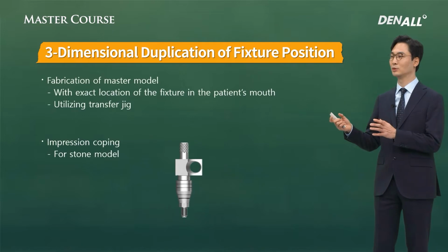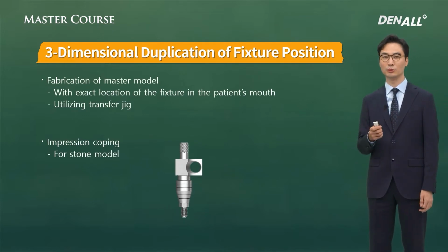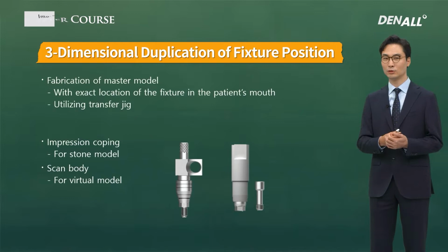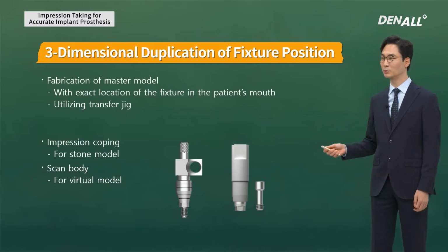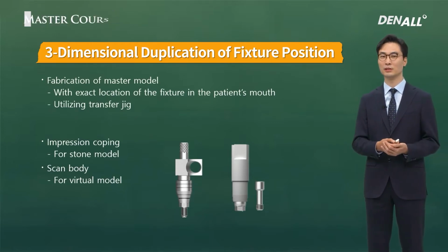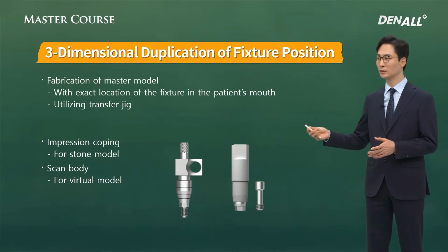Impression coping is the analog way to do it. Recently, scanner and digital dentistry is used. Scan body is used to come up with virtual model. Clinically, it is a similar process. Today, I'm going to talk about the analog ways, the impression coping, and impression taking.